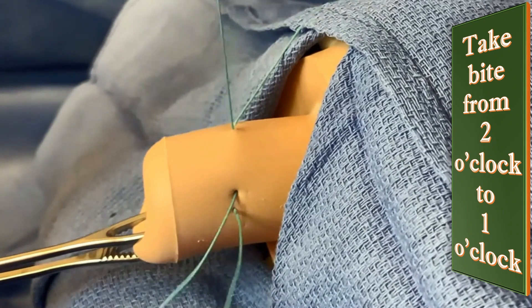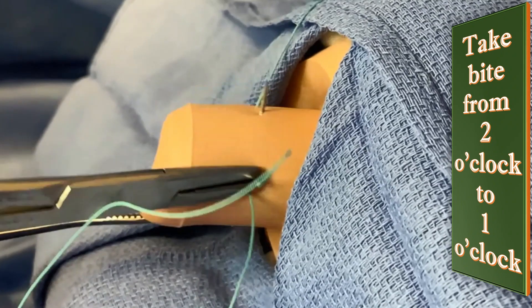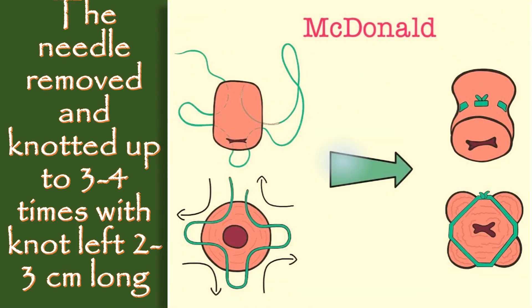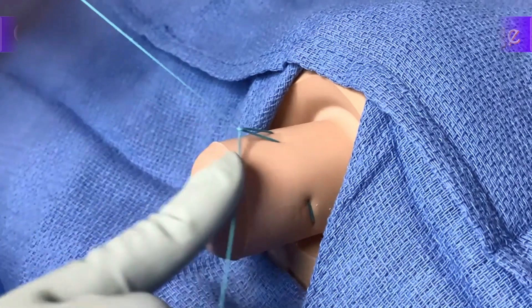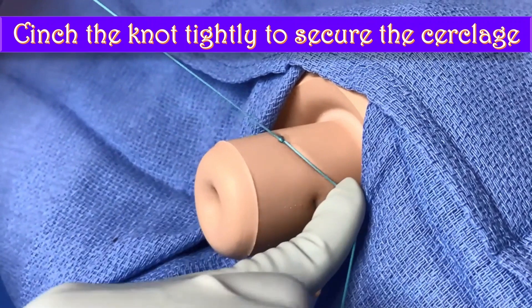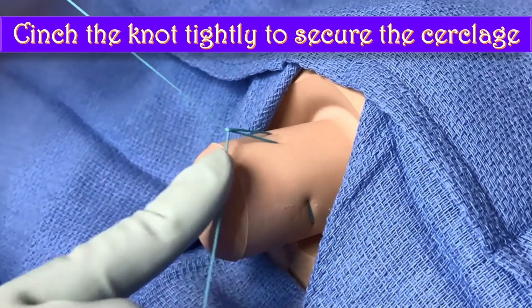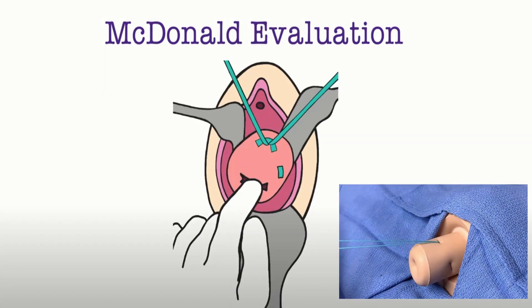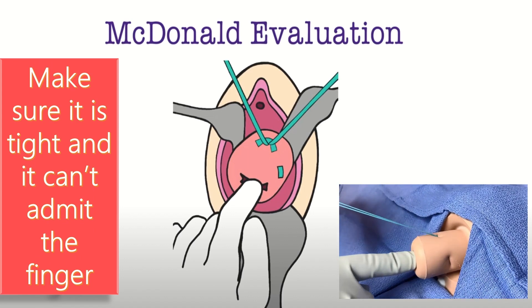The final exit point is at approximately 1 o'clock, near the initial insertion point. The needle is then removed and knotted three to four times, with the knot left two to three centimeters long. The knot is clenched tightly to secure the cerclage.